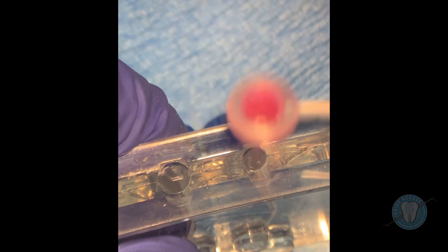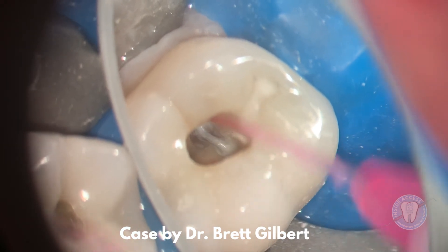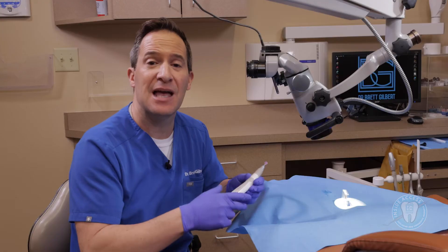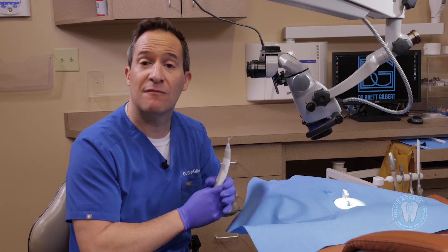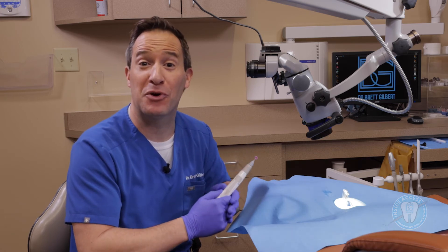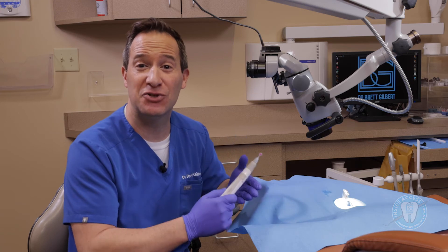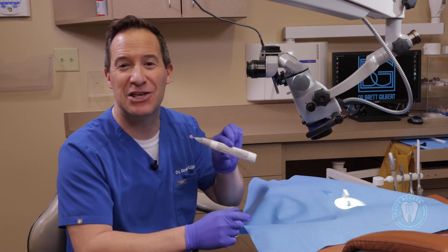Just taking it in and out like this, it's got a very nice feel to it. It has two speeds — if I adjust it to the lower speed, you can see that it slows down just a bit. It does have measuring markings, so you know exactly how deep you're going down into the canal. As this unit and the sodium hypochlorite react with real dentin, you get quite a bit of effervescence — a lot of bubbling — showing a tremendous amount of action going on. Between the polymer tip and the nice movement this vibration causes, this is a very useful, low-cost option for any dentist doing root canals to really up your irrigation game and get better effectiveness, better tissue dissolution, and better antibacterial properties.